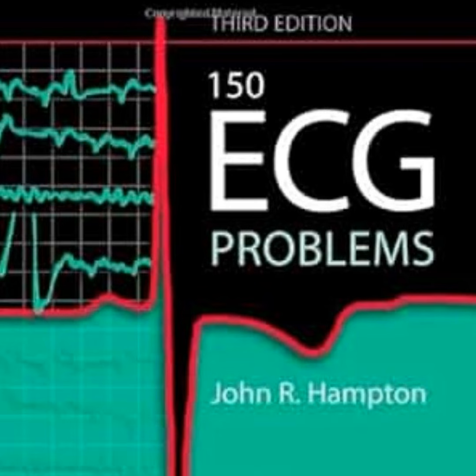But as Hampton points out, it doesn't operate in a vacuum. No, it definitely doesn't. The heart is bathed in the patient's blood, and he makes this really compelling case for the ECG acting as a sort of systemic mirror. I love that concept. Where chemical changes in the body profoundly alter the electrical signature on the paper. Let's talk about that. Well, electrolyte imbalances are probably the classic example of this systemic reflection, particularly when you're looking at the T wave.